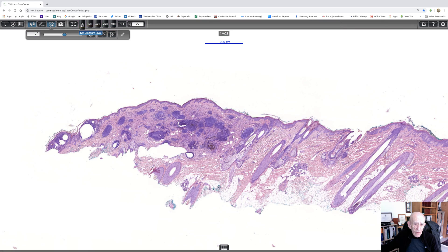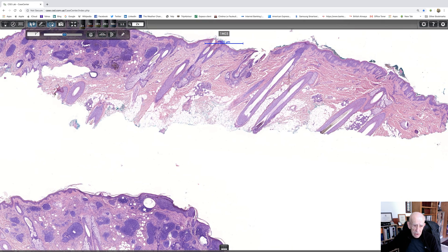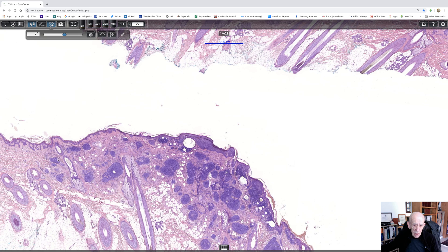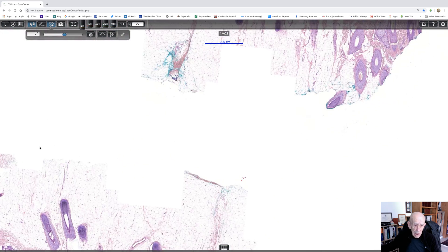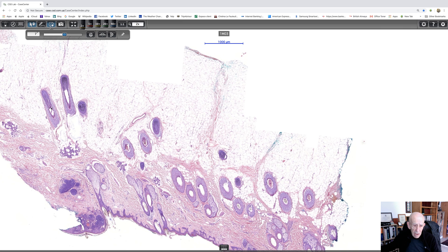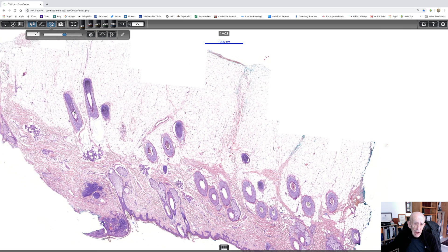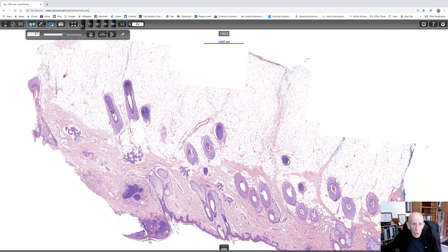There was a third bit, so I just wanted to make sure we're not missing anything important. Here's the third bit — and no, it's just an edge. I hope that's been of some interest to you. It's a beautiful example of a very typical trichoblastoma. Thank you very much for your attention.